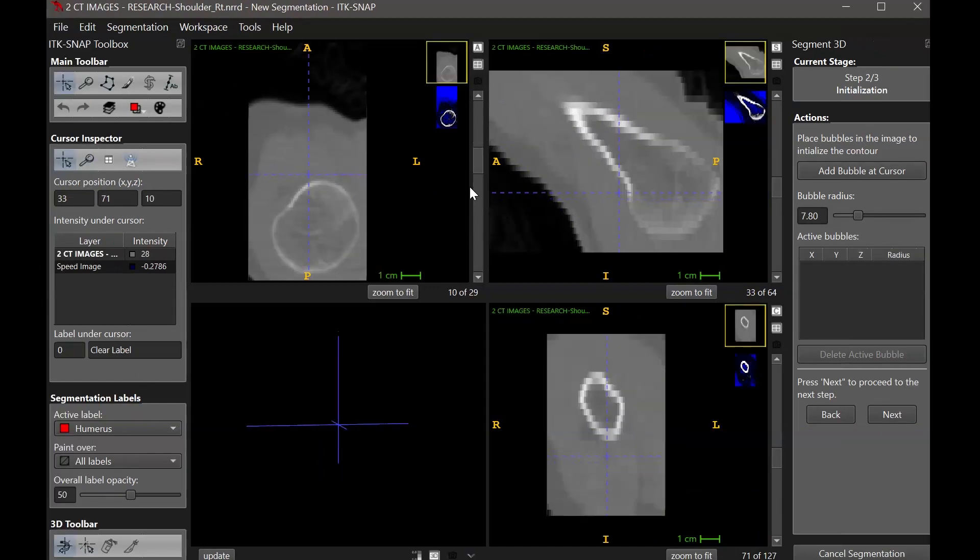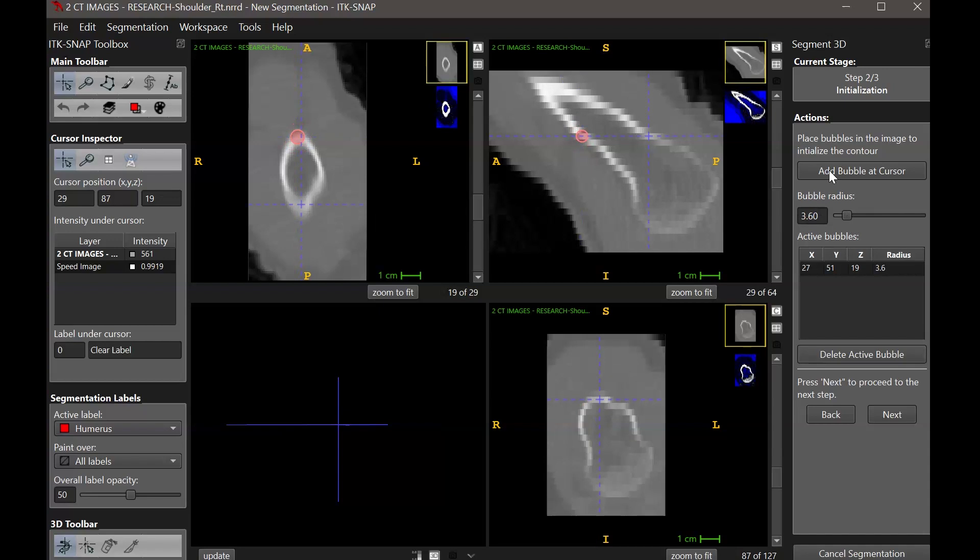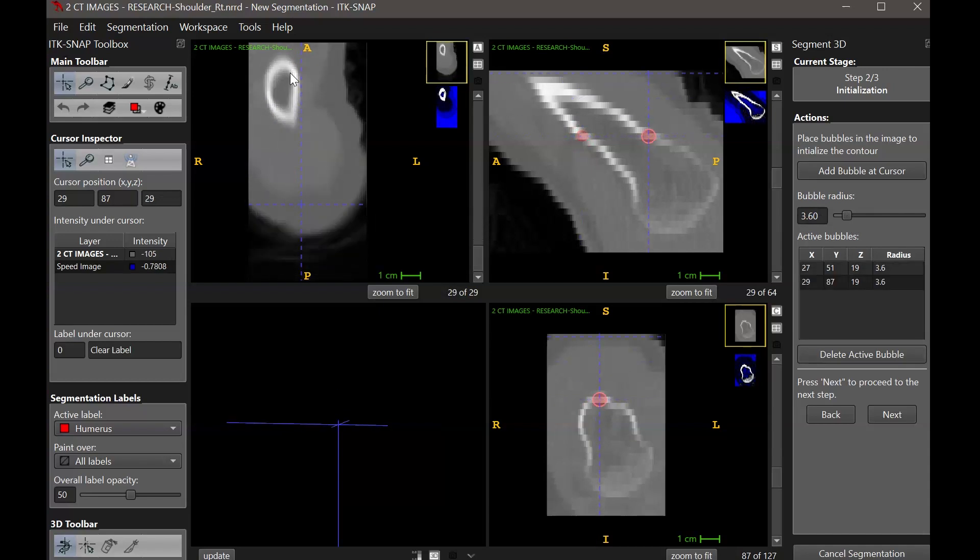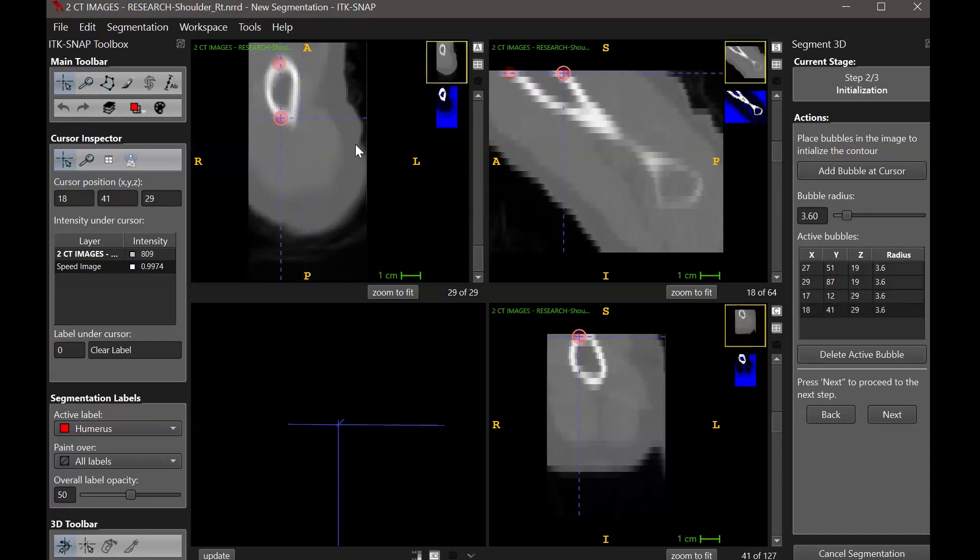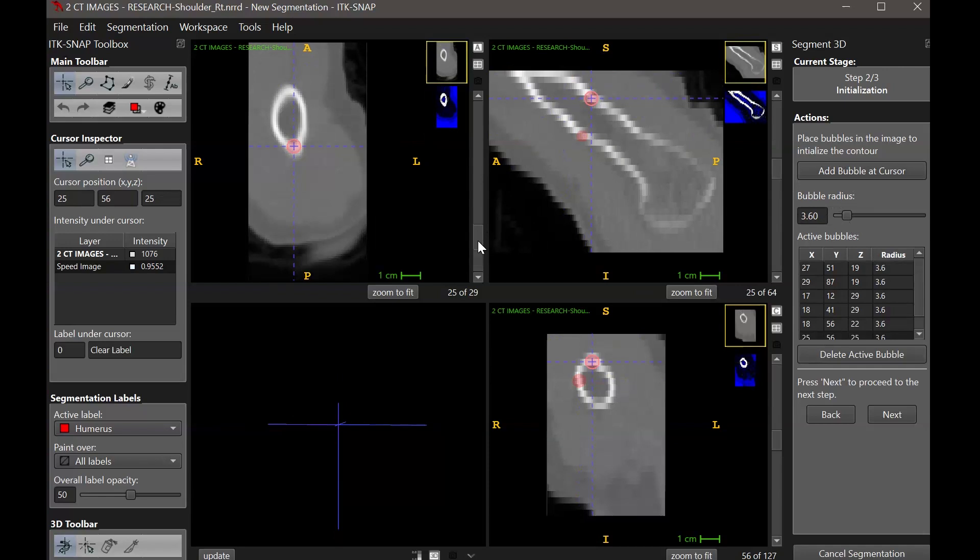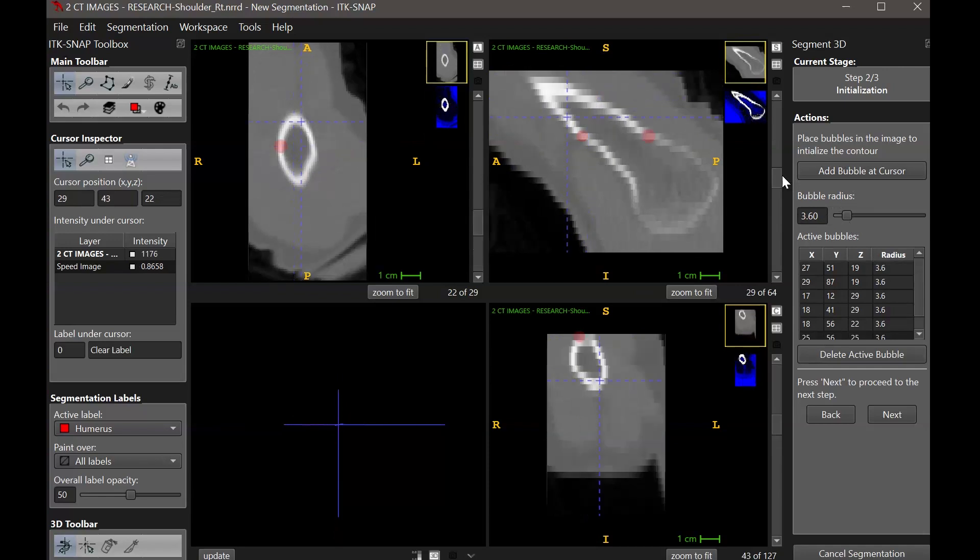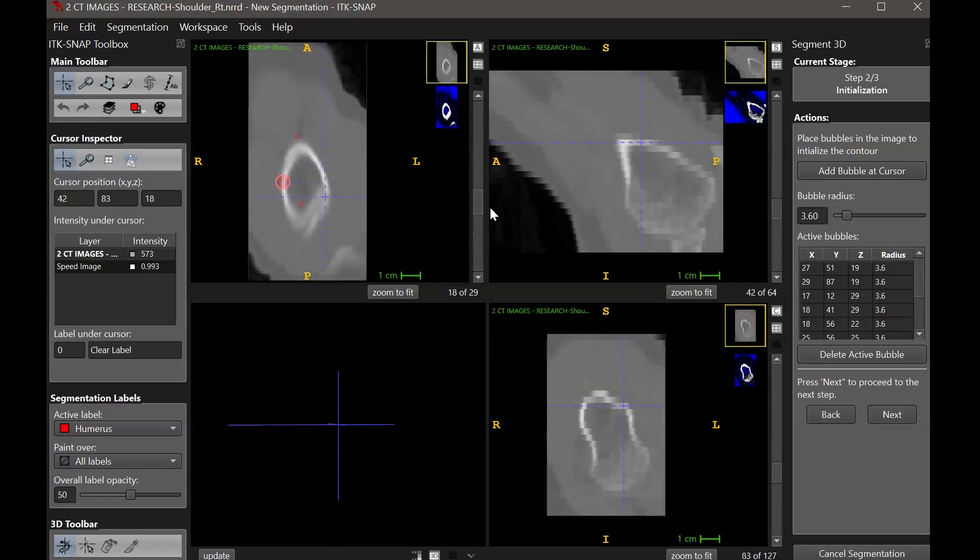The next step is initialization with bubbles. I'm going to select the areas of the image that the automatic segmentation should consider as starting points for the segment. I like to include bubbles at multiple levels and throughout the anatomical features.